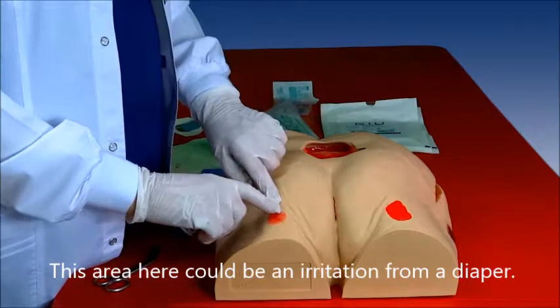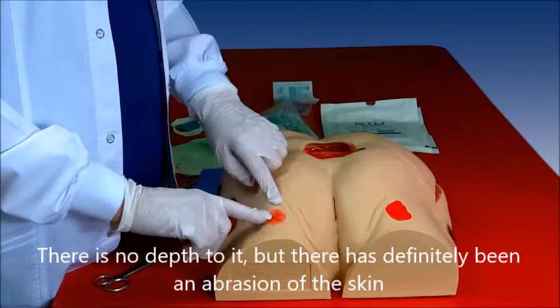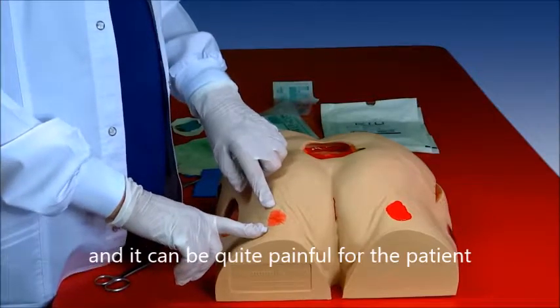This area here could be an irritation from a diaper. There's no depth to it, but there has been abrasion of the surface of the skin, and it can be quite painful for the patient.